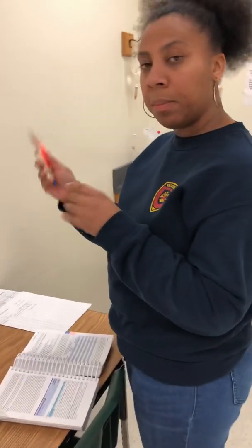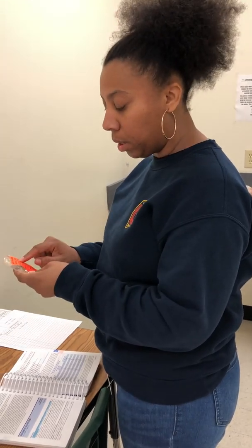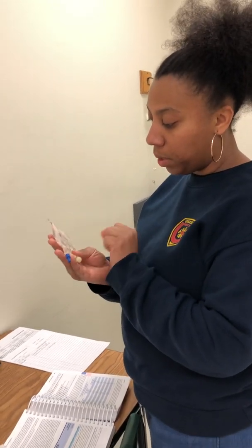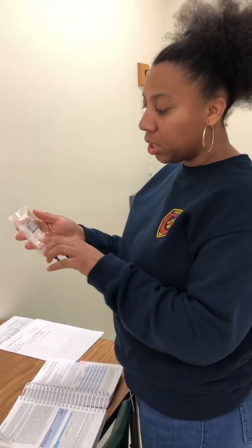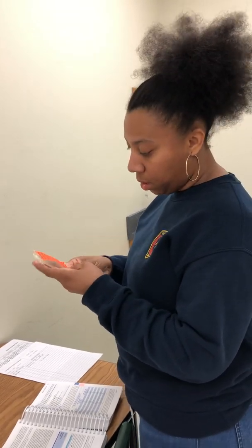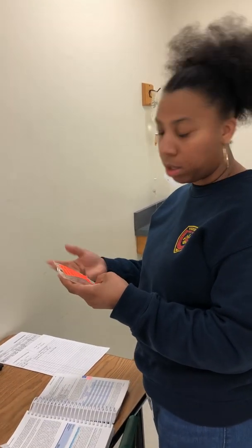I would get my medication, and I would get the label, write down my medication, the amount of it, the day and the time that I'm giving it. I would check my expiration date on my medication to make sure it's not expired. Check for discoloration. Check for any type of particulate matter in it. Make sure there's no leakages and that it's still sealed. I will also put the patient's name and room number and the time that I'm going to start.